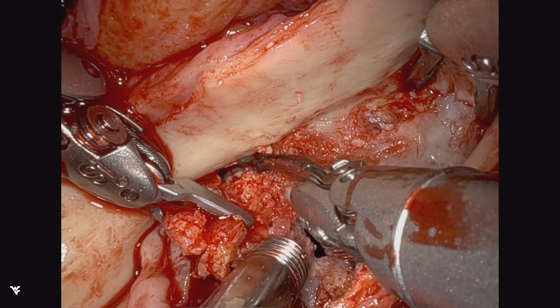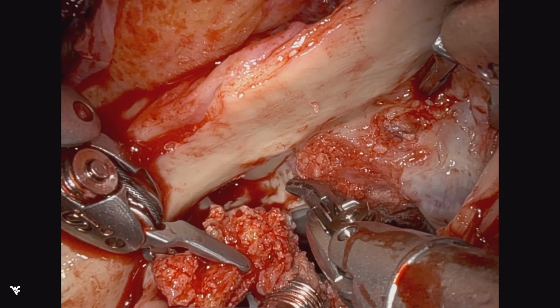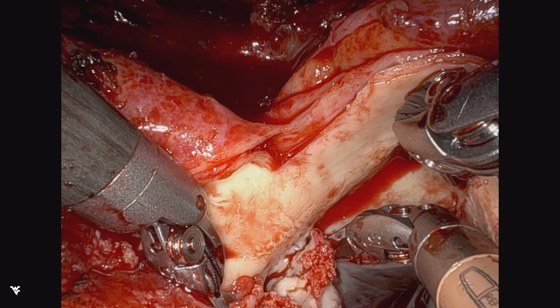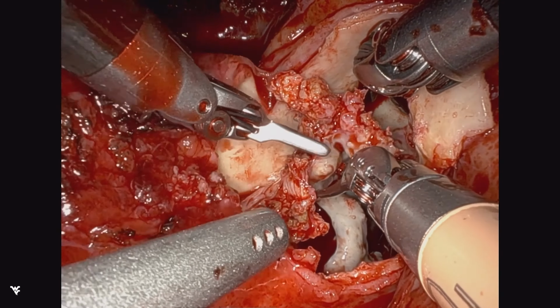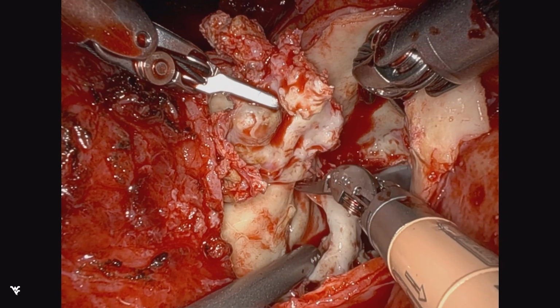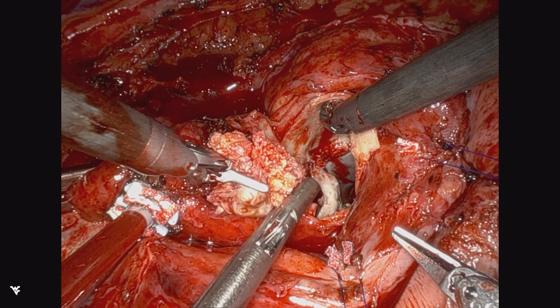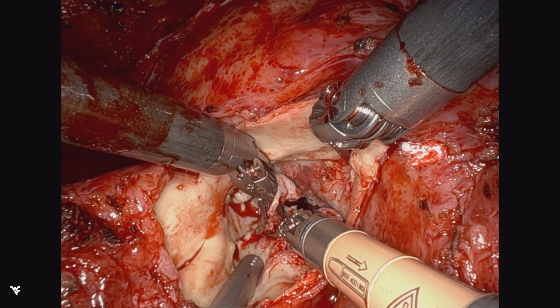and continuing the debridement. You can start to see a little bit of loss of domain there, which we will address. But the important thing is to get this calcium out. For our cardiology colleagues, this is exactly why we respect the calcium scores and heart team assessments, so we can determine the safest approach. So once the calcium of one leaflet is excised, we still have a lot of work to do. We still have some more to go.